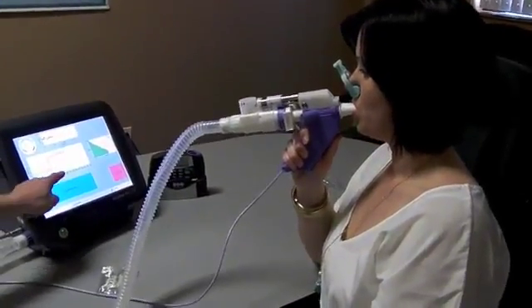As you can see here, she's still within her range of the 1.5 plus or minus liters per second.